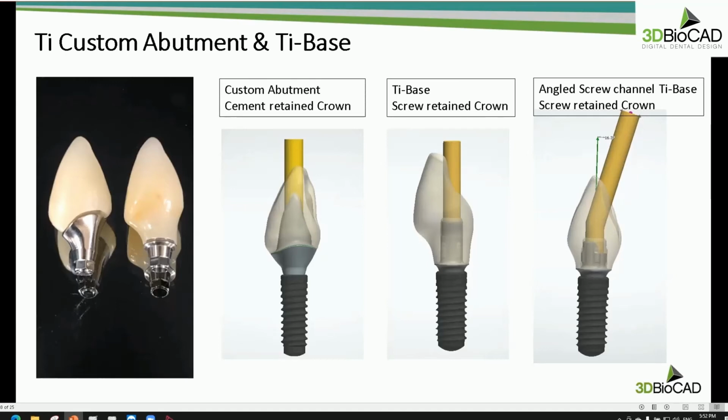So whenever you have a chance and plan to make an angled screw channel restoration with a Ti base, please discuss with your laboratory first, okay?